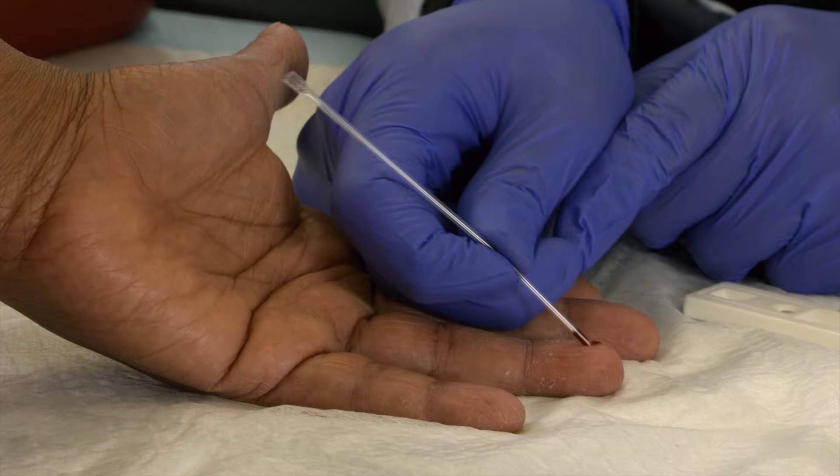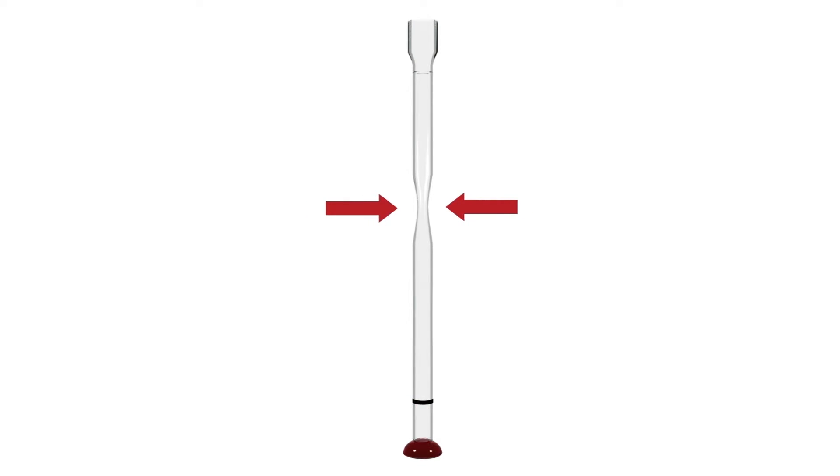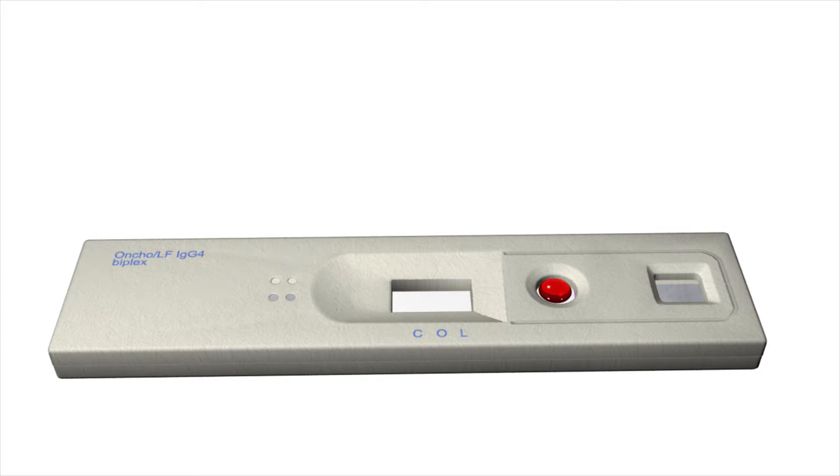Gently place the same end of the tube that was used to collect the blood into the round sample well and squeeze the capillary pipette to release the blood. You do not need to use any force when putting the pipette into the round sample well. You should be able to see the blood absorb into the well.